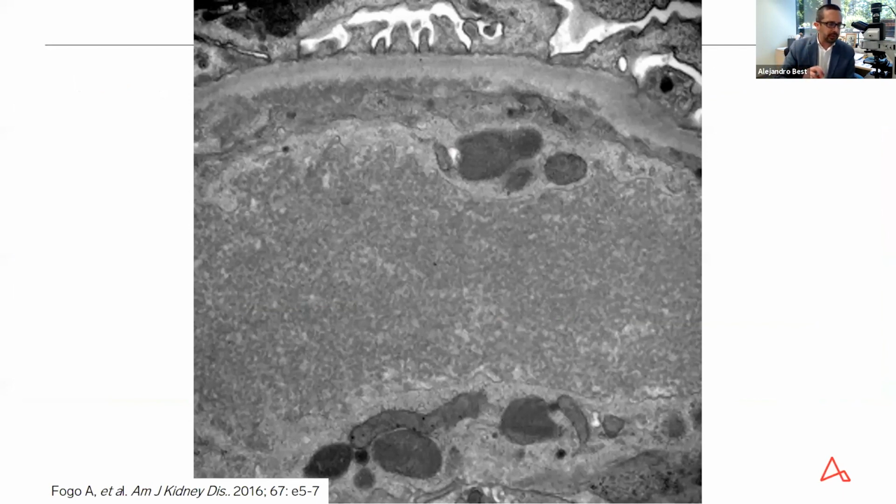So substructure, and I'll finish with this. You'll read in all the textbooks that cryo has an MPGN with hyaline thrombi, it stains for blah, blah, blah, everything that we discussed, and it shows substructure by ultrastructural examination. Let me tell you, this is the exception rather than the rule. I wish this was true, but I can tell you that a vast, vast majority in real life practice will not have a substructure. So if you're wanting to hang your hat on substructure, you're going to miss most cases of cryo. But sometimes you do get lucky and you see it.